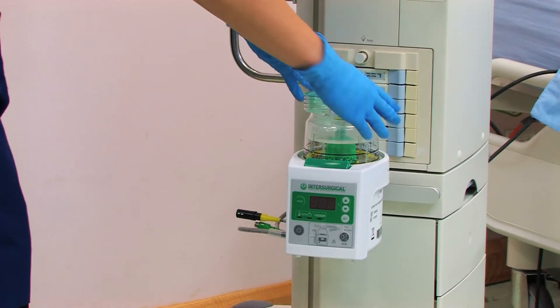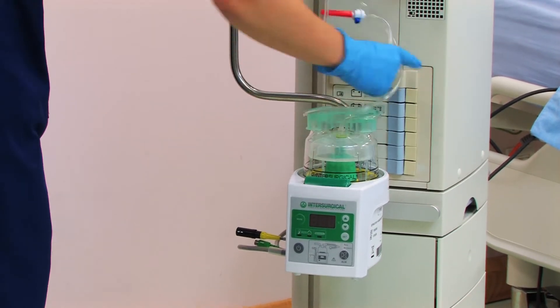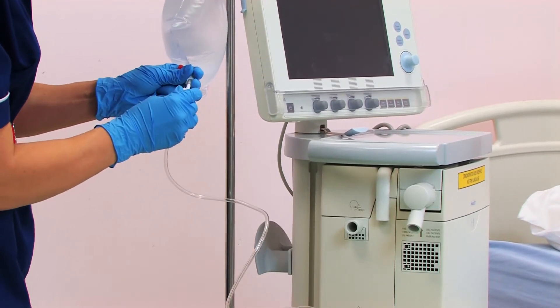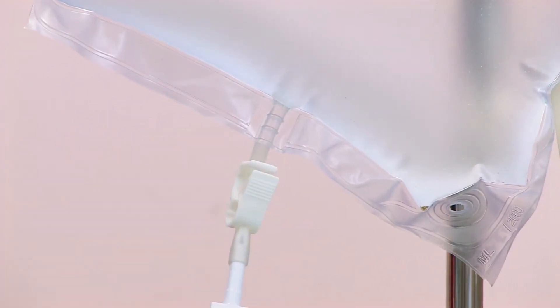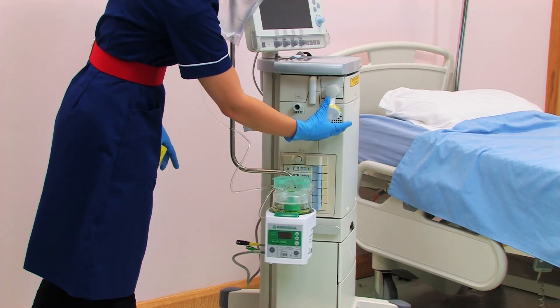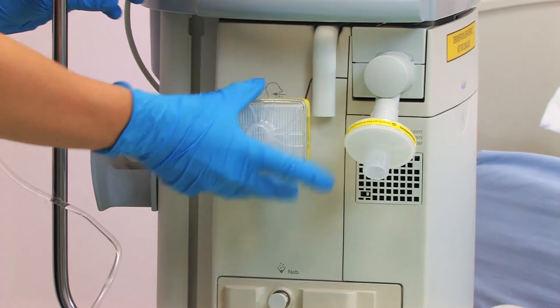Add water to the humidifier chamber. In this case we're using an autofill chamber. To protect the ventilator we are using a low volume, low resistance filter on the expiratory limb and a high efficiency filter on the inspiratory limb.